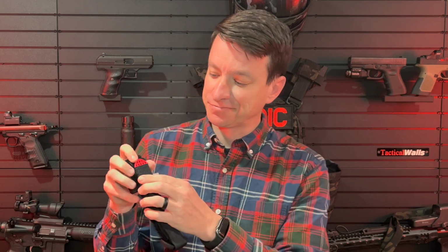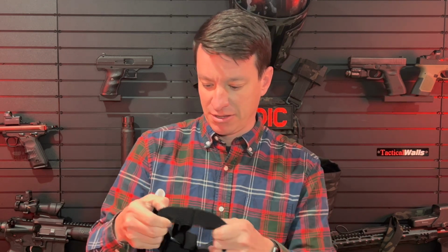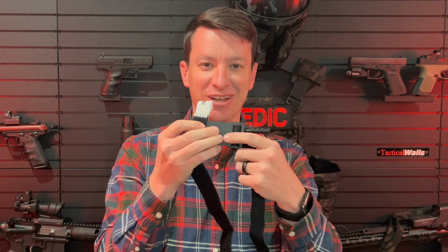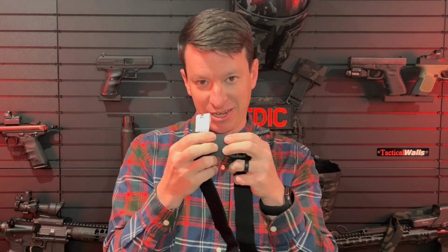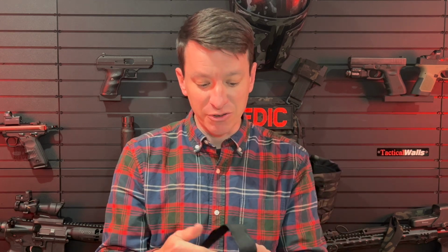So I looked at that, and then I looked at this red tip right here, and immediately saw that that did not look appropriate. So I was like, all right, cool. Open up here on the back plate. It's absolutely nothing. There's no printing. There's no North American Rescue, CAT Resources, nothing here. So this is a Chinese toy that was made in China, and it's a toy. It's not a life-saving device.